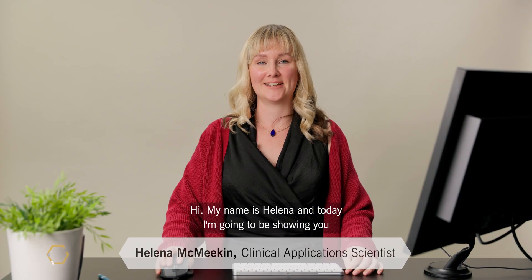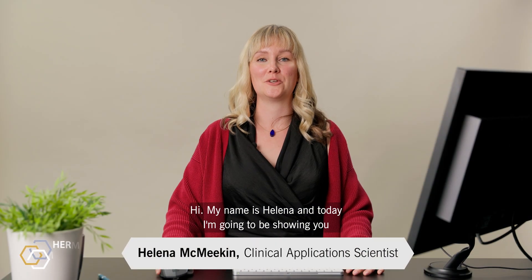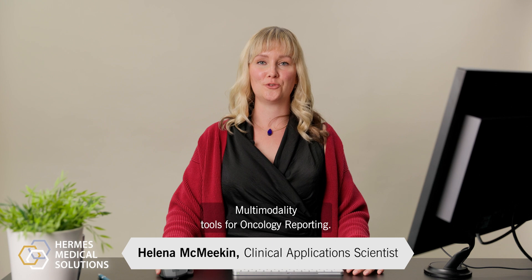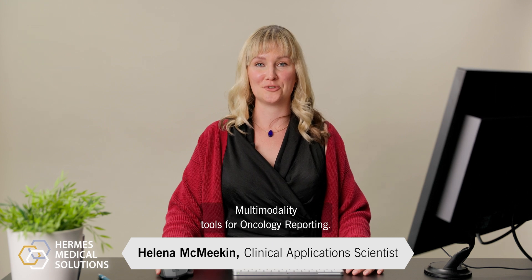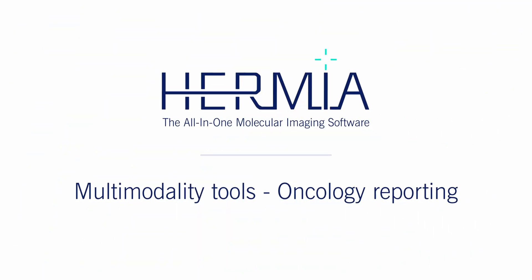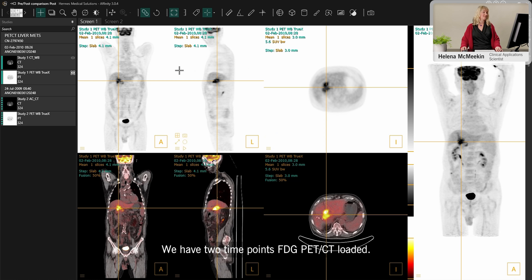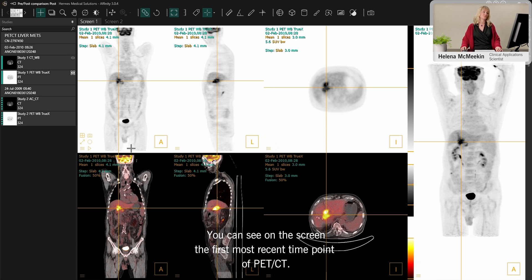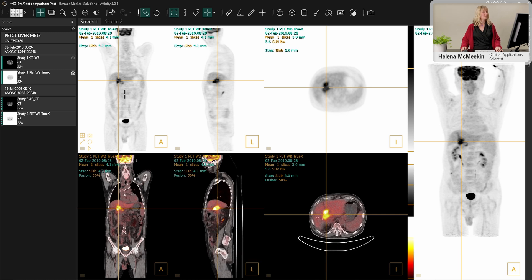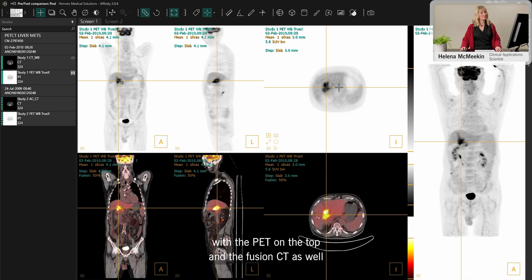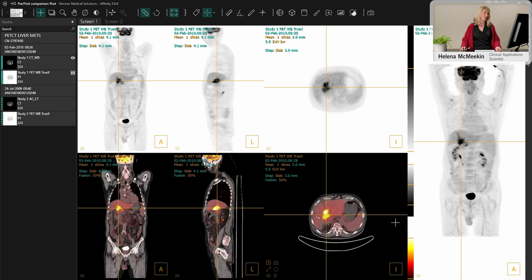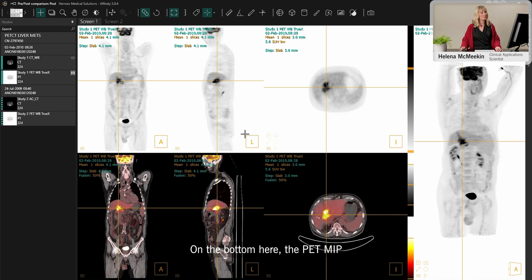Hi, my name is Helena and today I'm going to be showing you multi-modality tools for oncology reporting. We have two time point FDG PET CT loaded. On this screen you can see the most recent time point of PET CT, with the PET on the top, the fusion CT on the bottom, and the PET MIP.